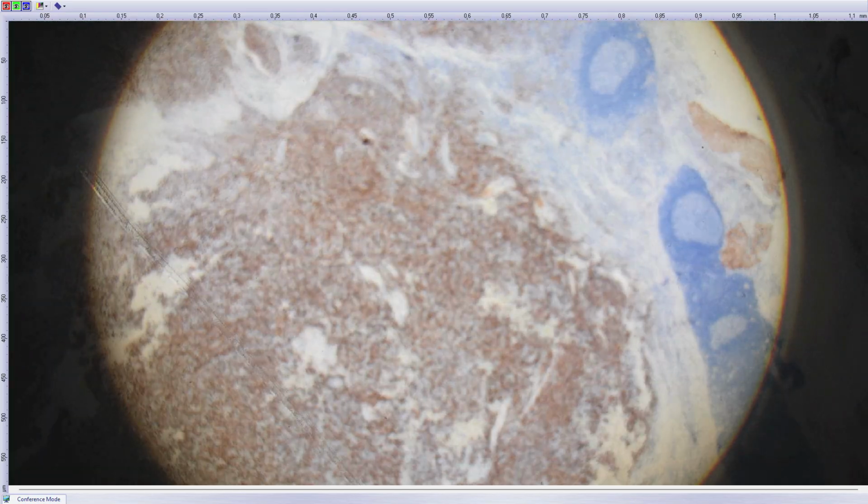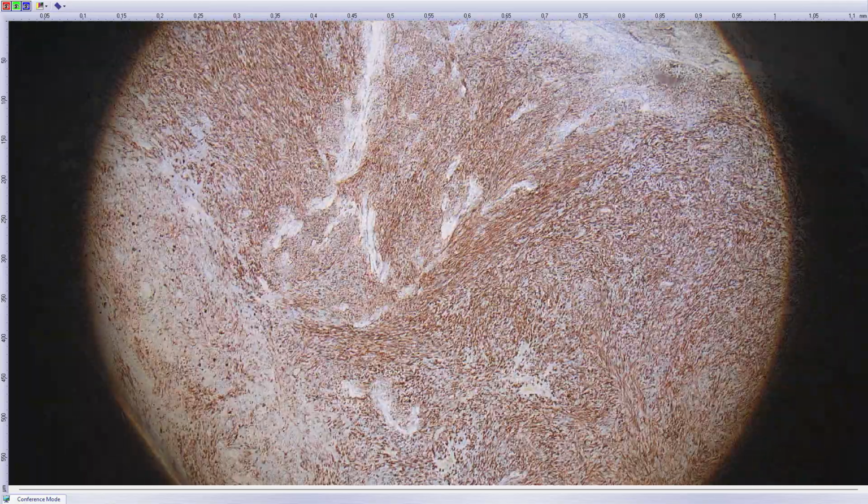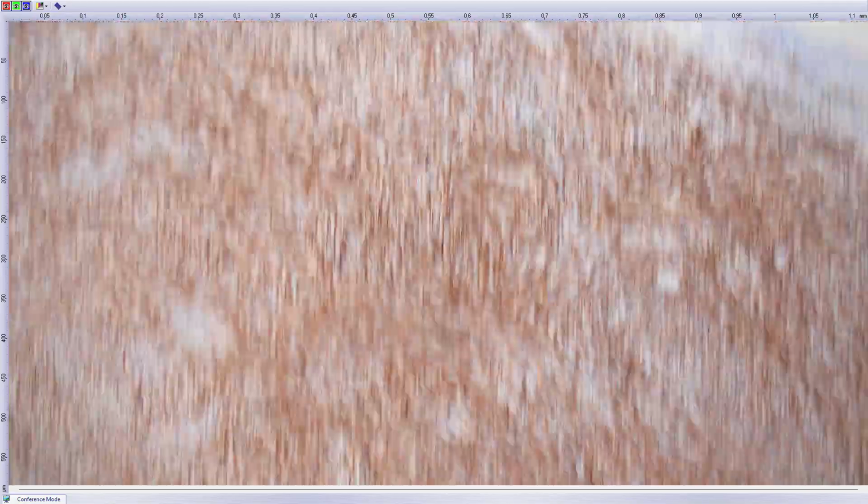So since we don't know what this could be, we can do just a basic immunohistochemical panel, which is useful for mesenchymal tumors. So again, S100, EMA, cytokeratins, desmin, SOX10 maybe, CD34, those are the markers I would start with in a case like this, and most of them were negative, apart from this one, which is desmin. You can see diffuse, strong expression in the tumor cells.